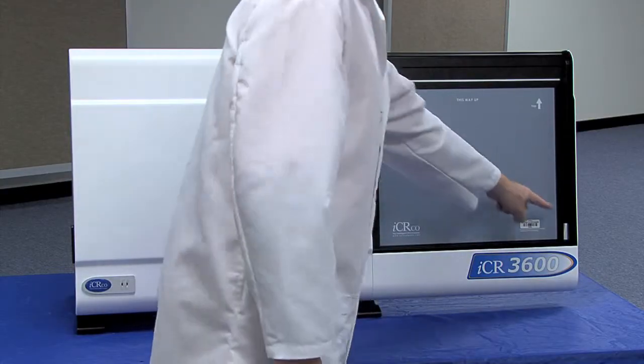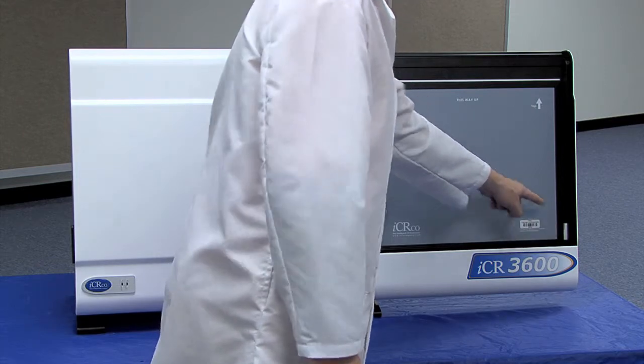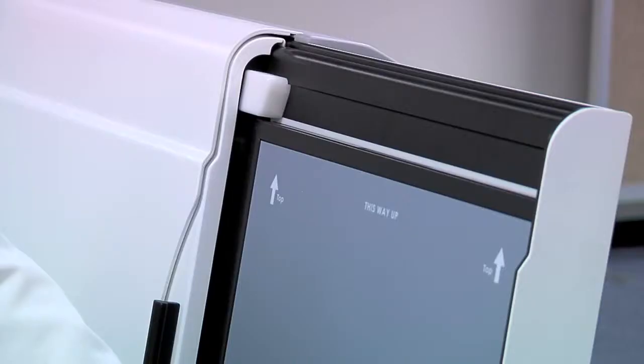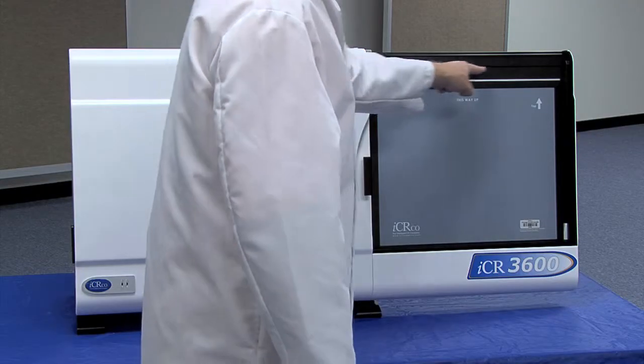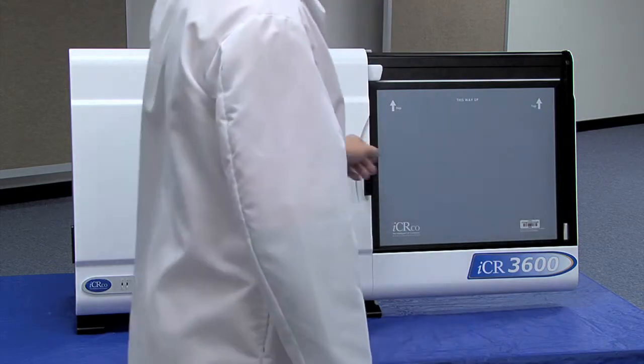Visually inspect the cassette. Note the two loading blocks located on the top left and bottom right of the bezel. If loaded correctly, the cassette will be resting underneath the loading blocks and the 14x17 guidelines will be completely visible.